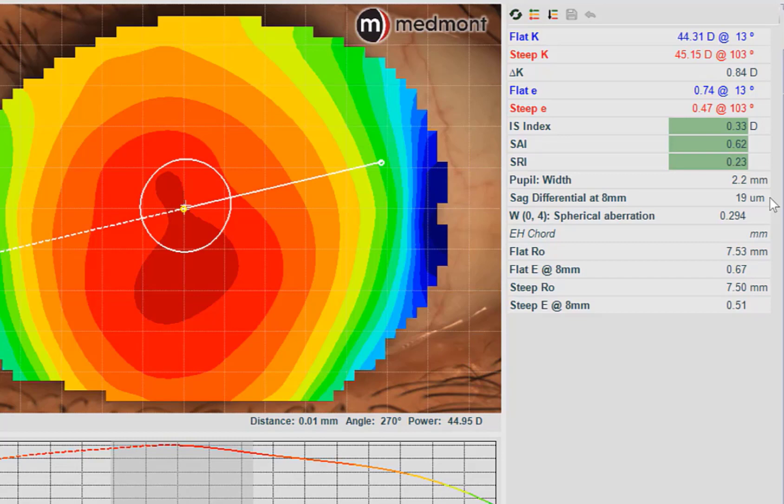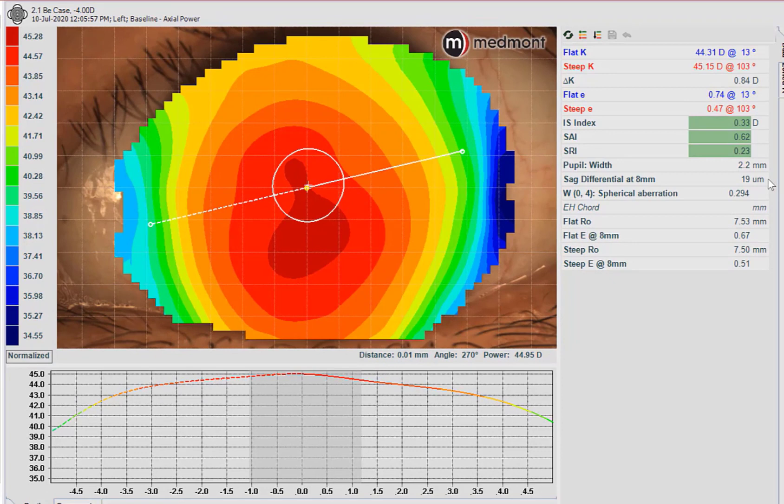The sagittal differential shows this patient has 19 microns of difference between the height of the flat and the height of the steep meridian. This would suggest we should use a symmetric non-toric landing ortho-K lens. At around 30 microns, that's where a toric rigid contact lens typically performs better. So 30 microns or greater of sagittal differential, and we should be thinking toric. In this case, the patient is well below that threshold, and a symmetric landing would be the preferred choice.